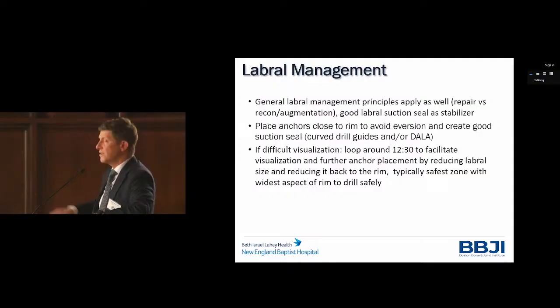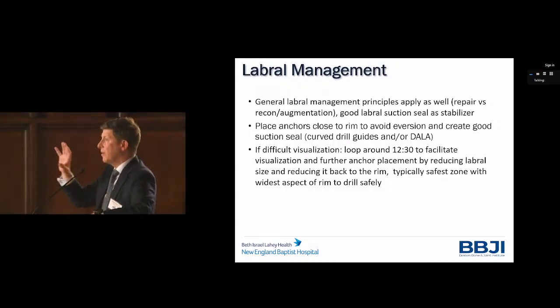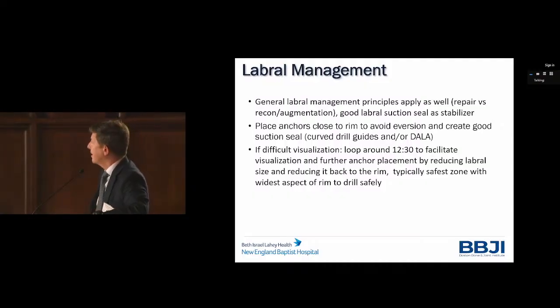If you have difficult visualization getting in, and you have this large labrum in your face, I'll start with about 12 or 12:30 clock position, place a suture, loop it around, and bring the labrum back out of view. In that section, around 12:30 to 1 o'clock, the acetabular rim is pretty wide, so it's a safe zone in my hands to put the labrum in, then reduce it, and work your way back and forth to stabilize the labrum.